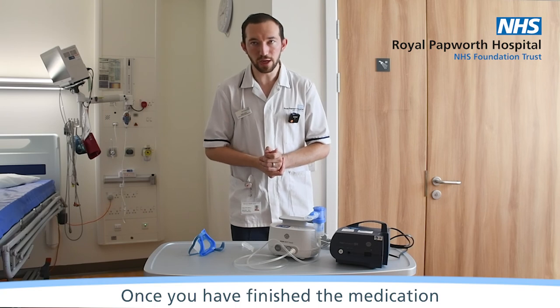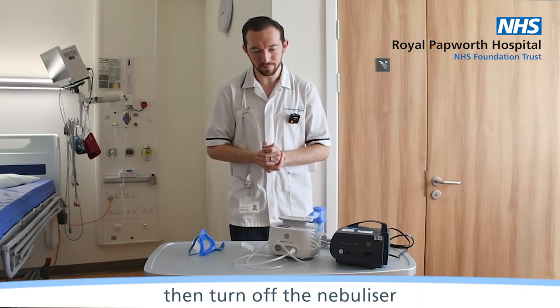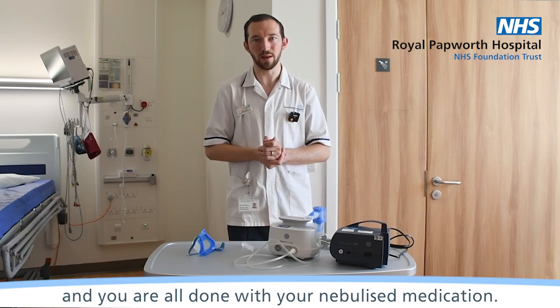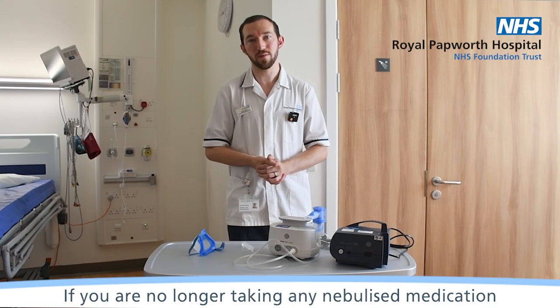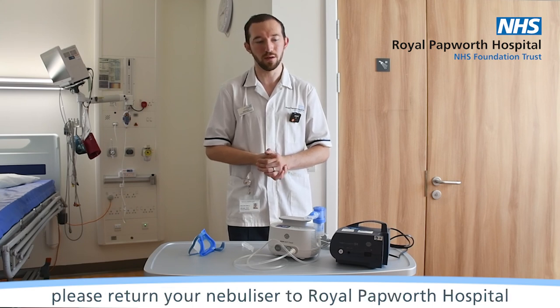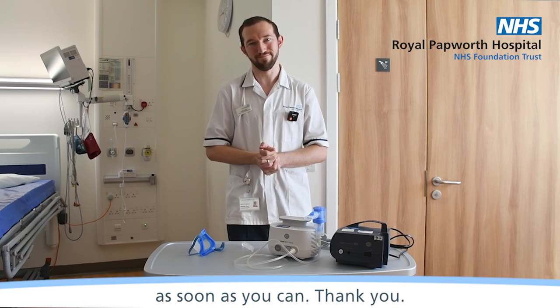Once you've finished the medication, turn off the nebuliser and you're all done with your nebulised medication. If you're no longer taking any nebulised medication, please return your nebuliser to Papworth Hospital as soon as you can. Thank you.